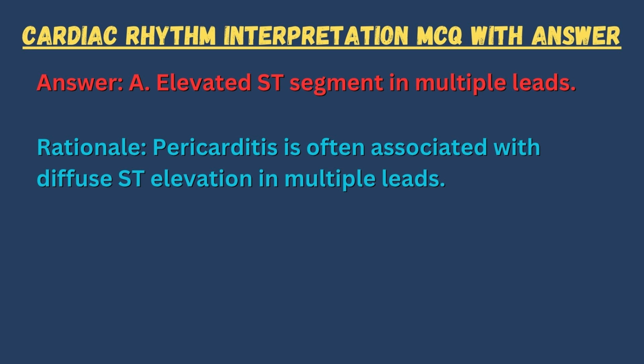Answer. A. Elevated ST segment in multiple leads. Rationale. Pericarditis is often associated with diffuse ST elevation in multiple leads.